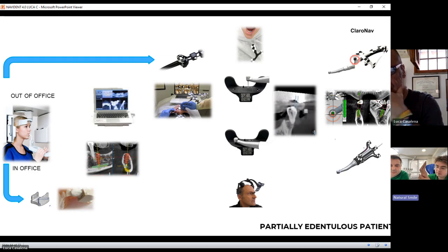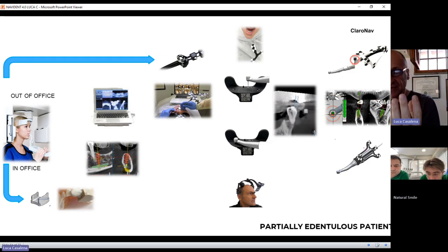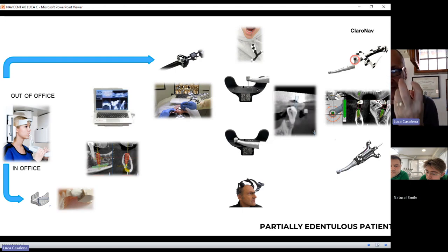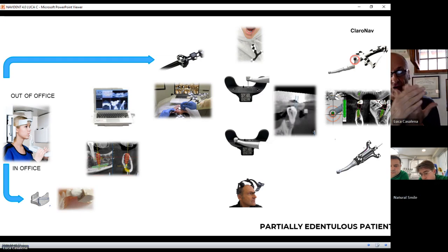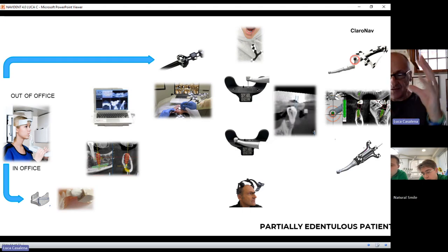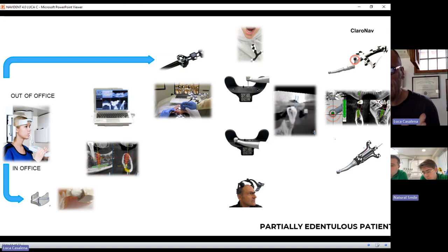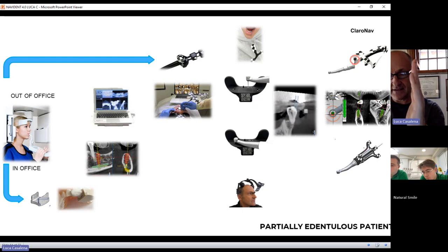Imagine this is the vestibular side of the premolar — this is the cusp, the trigger point. You take the tracer and trace it. You need to take the full volume while tracing; you cannot stick to just the vestibular surface because that is a plane, not a volume. You want to draw a volume, meaning you collect points on the vestibular side, the occlusal side, and the lingual side. By tracing these three areas, you get a volume.